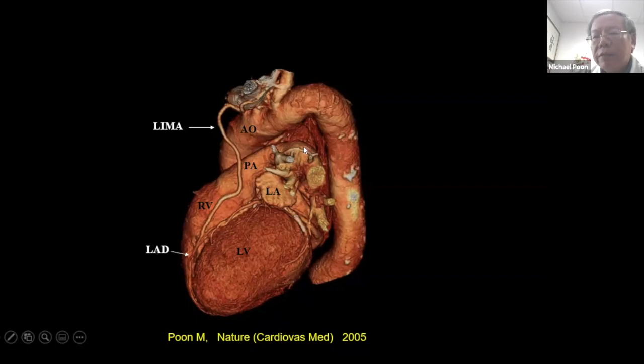Can we fix it using the catheter that Dr. Singh talked about probably last week? And basically using a wire and catheter to go inside the graft and open it.